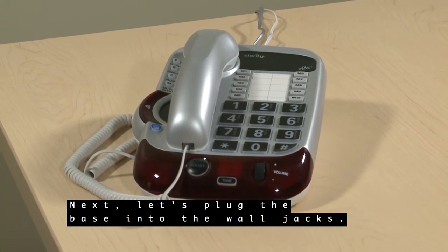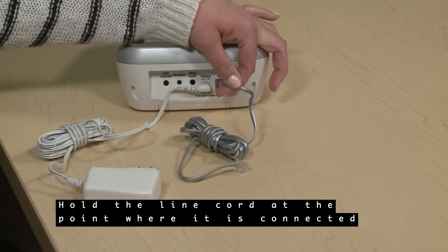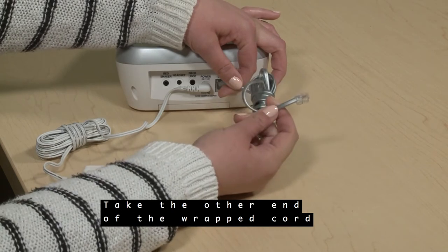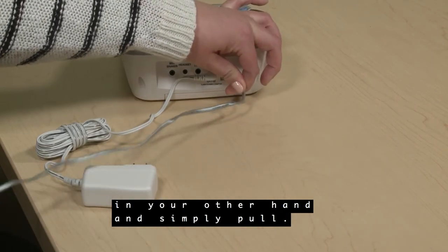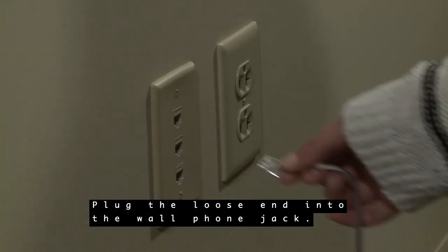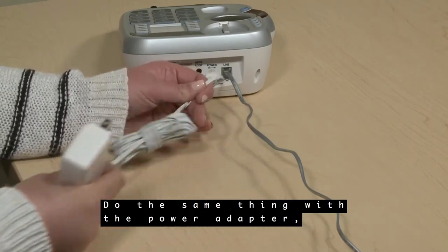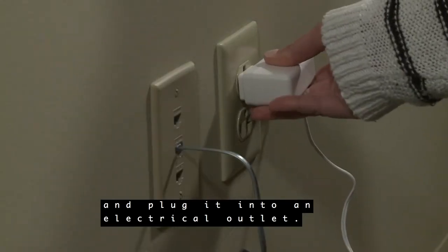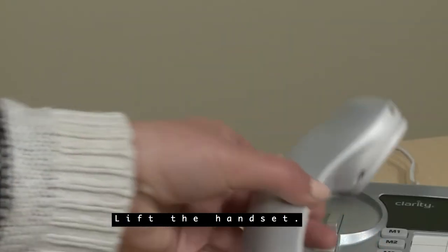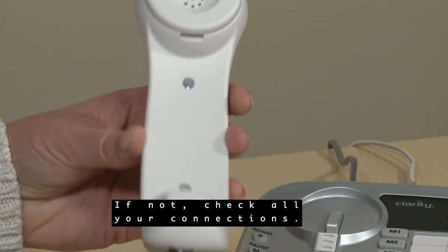Next, let's plug the base into the wall jacks. Hold the line cord at the point where it is connected to the base with one hand. Take the other end of the wrapped cord in your other hand and simply pull. The cord will extend to its full length. Plug the loose end into the wall phone jack. Do the same thing with the power adapter and plug it into an electrical outlet. Place the handset onto the base's cradle, then lift the handset. You should hear a dial tone. If not, check all your connections.